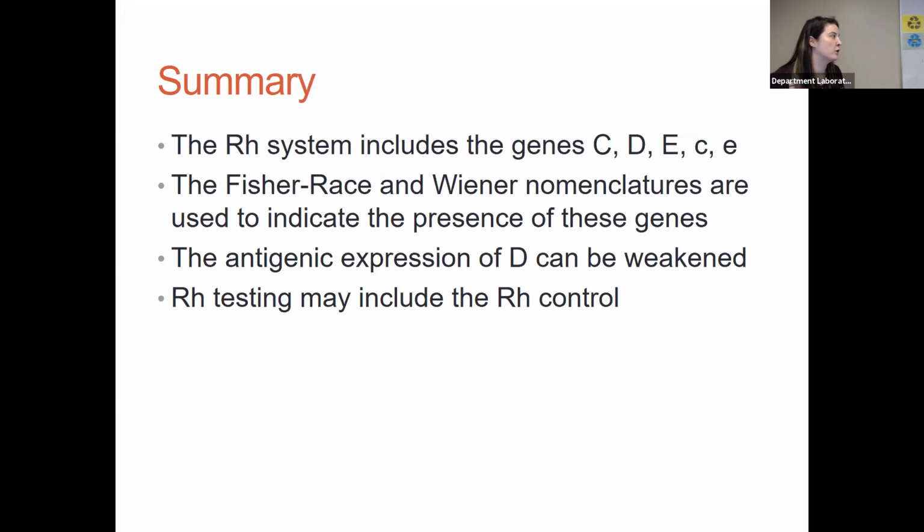And then make sure that you're aware that the Rh testing sometimes will include the Rh control. You guys will always do it in this course. Don't be surprised if you go to the clinical lab and they're not including the Rh control. However, if you have an AB positive patient, you will always have to have that Rh control.